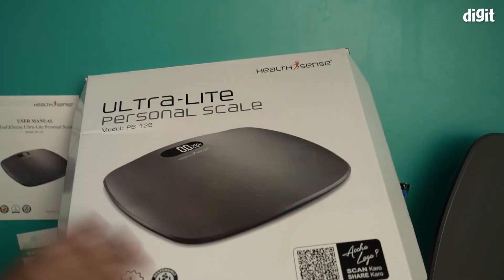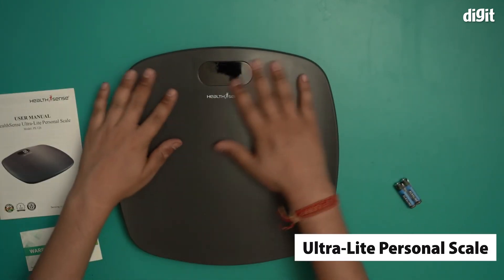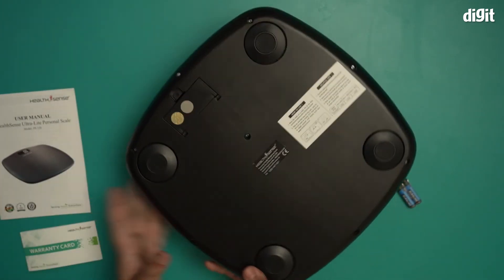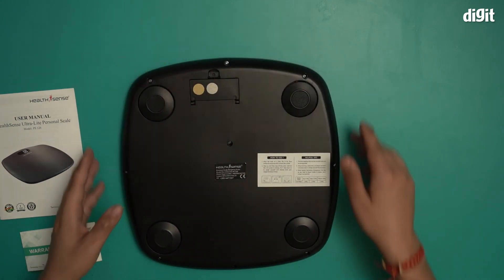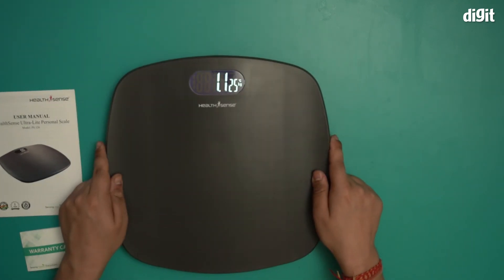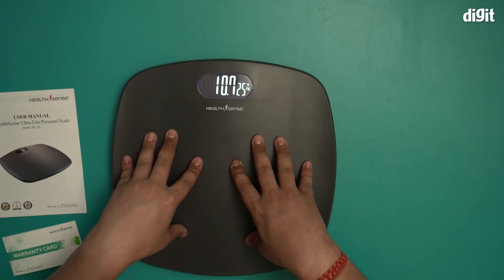There is the scale itself — this is what it looks like. Let's flip it around at the back and put the batteries in. Once the batteries are in, let's place the scale on a solid surface. As you can see, with the batteries in, the indicator is displaying. And if you put some pressure on it, it will give you a reading.